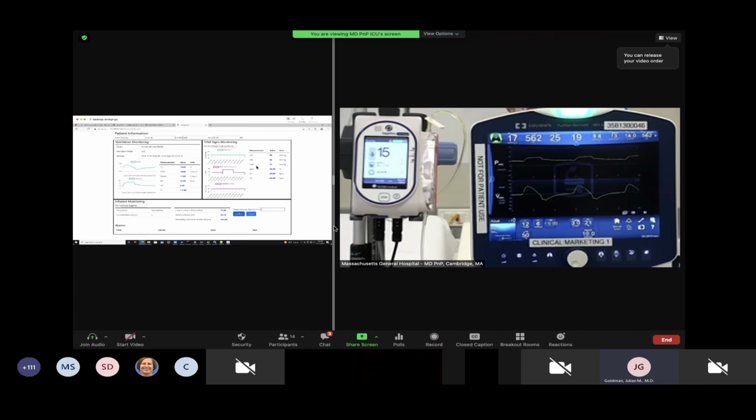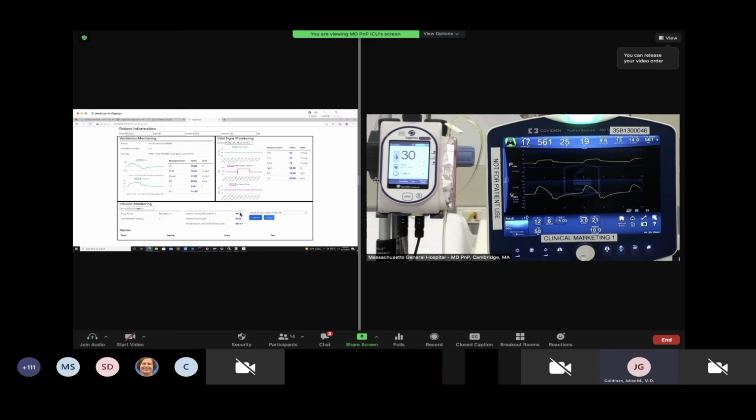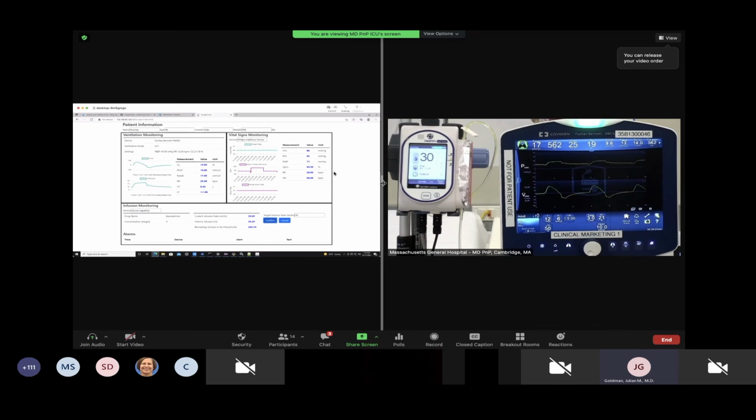Okay, I'm checking back in. How are you guys doing now? Let's see. I'm watching. I see that the pump has changed its rate and is now running at 30. And I'm looking at the blood pressure, and I see that the blood pressure is already starting to come back up. Perfect.